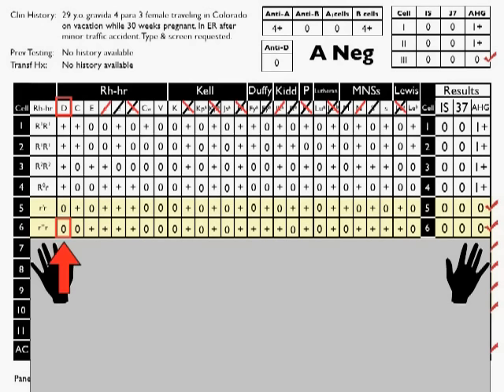There are some immunohematologists, however, that once they get one single diagonal slash with a homozygous or double dose rule out, then they won't do additional ones. I personally prefer to do them, but you'll definitely see people that don't. And I'll show you how that looks in just a few minutes when we go to case 2. Okay, let's cruise on, look at cell 7.